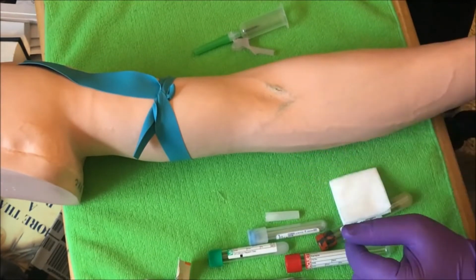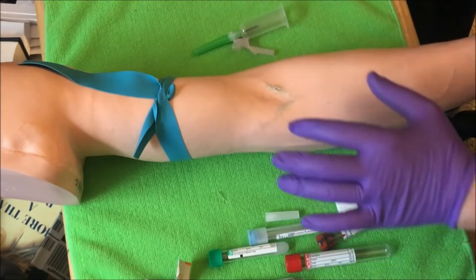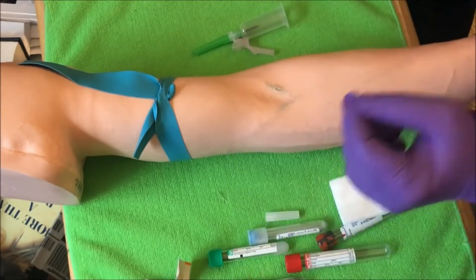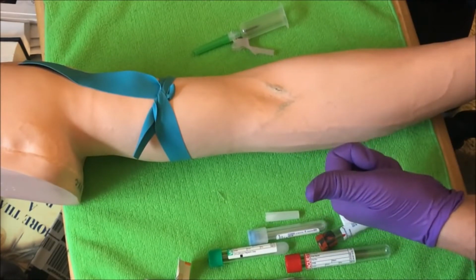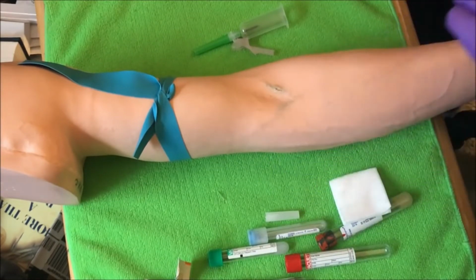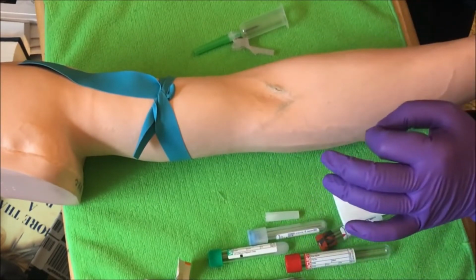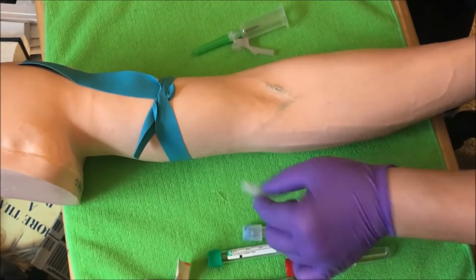Now, again, you cannot touch the site. You cannot repalpate. Once you alcohol the site, it's off limits, so you better know where you're going. This is where your skills kick in. And as many times as you do a blood draw, that's going to tell you where it's at. You should automatically be focused on where this is. And I'll show you another technique afterward about marking the site with your cap here before you alcohol.